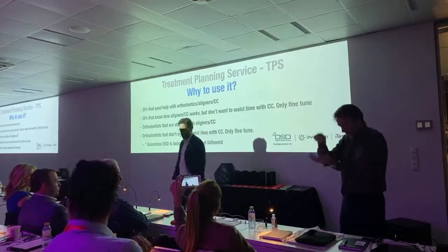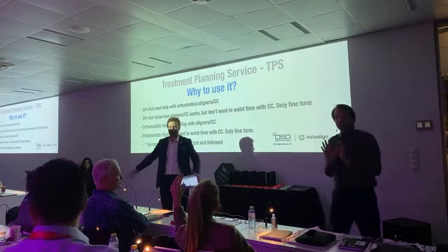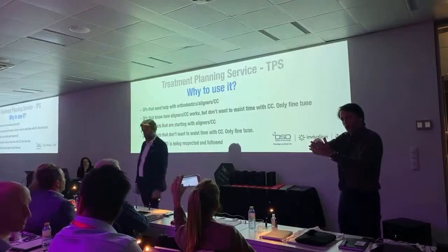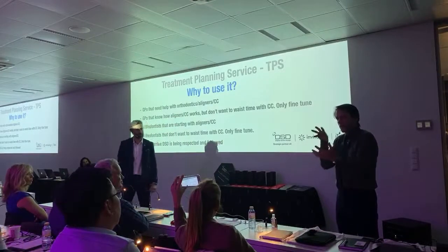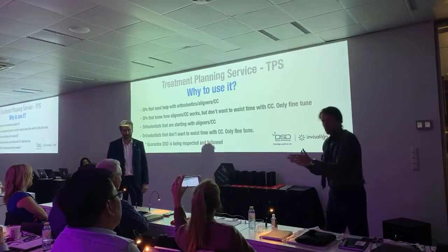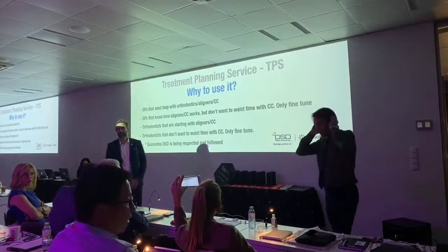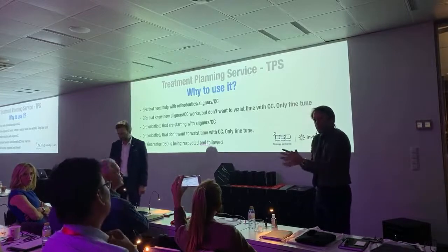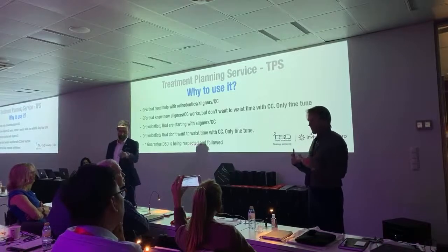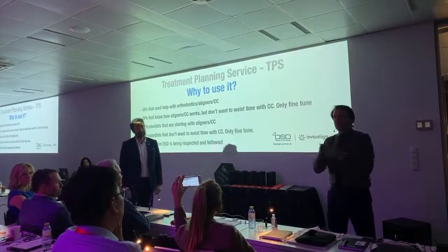The final approval is always yours. It's like an Invisalign TeamViewer. Where you jump in, it's an orthodontist from a different company that is getting into your case and doing the ClinCheck for you, and then you look, you fine tune, you approve, and that's TPS. So TPS can be for other providers. Invisalign has to officialize third parties to be official TPS, and that's the thing that we became recently, a treatment planning service.